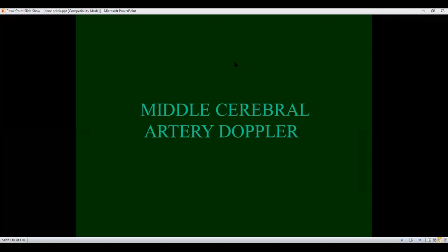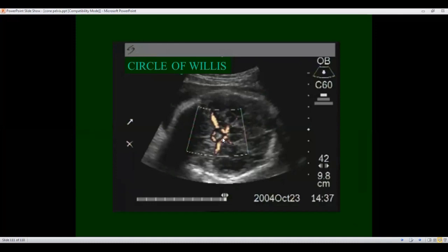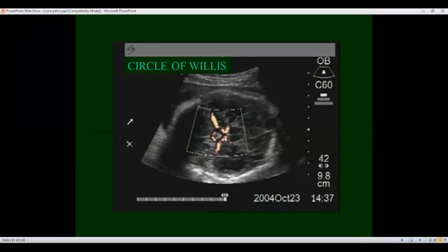Middle cerebral artery Doppler. In the head we will discuss the anterior, middle and posterior cerebral arteries and we will see the circle of Willis made up of the anastomotic branches of the internal carotid and vertebral arteries. If you closely look you can appreciate two long arms of some animal having two small legs - we call this a flying monkey. This is the head, these are the two legs, and these are the two long arms. These long arms are the middle cerebral artery arising from the circle of Willis.